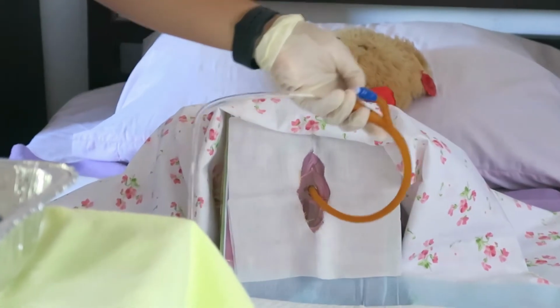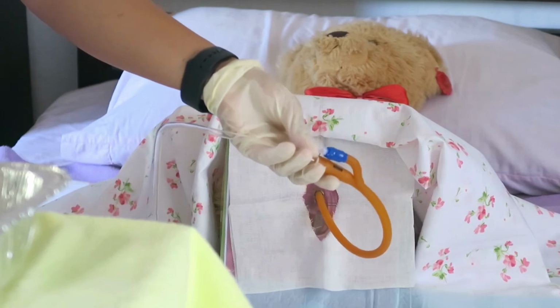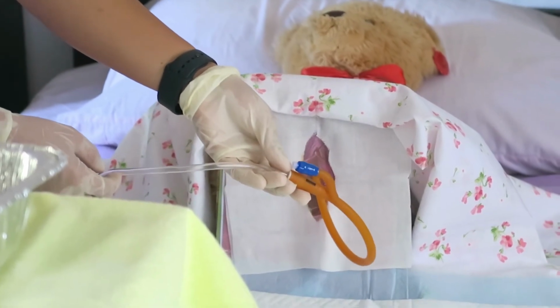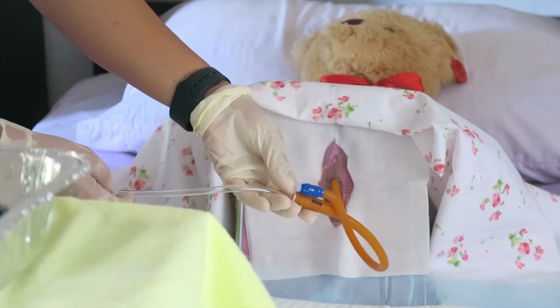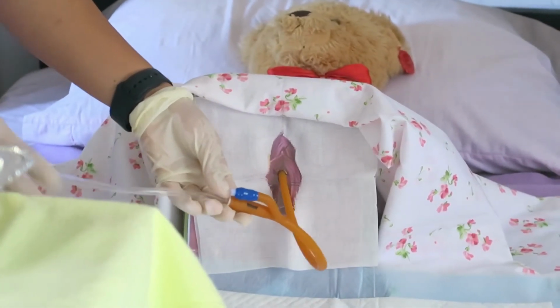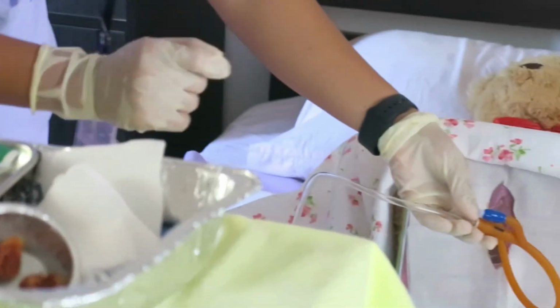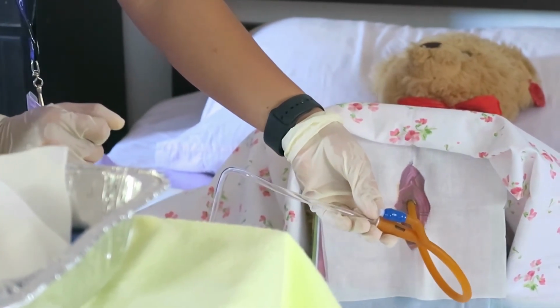So after that, inflate the balloon 10 to 15 cc of sterile water using a 10 to 20 cc syringe. Make it sure that there will be no leakage of water from the balloon, thus it serves the purpose of anchoring into the bladder. Secure the indwelling catheter by taping into the patient's thigh. Allow some slack of the tubing to accommodate the patient's movement. This is to secure the catheter properly. Slacks prevent tension on the catheter when the patient moves.